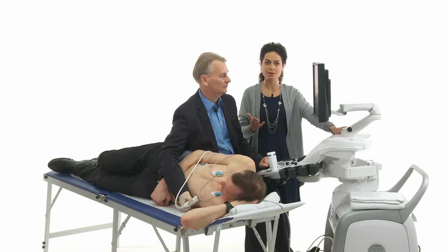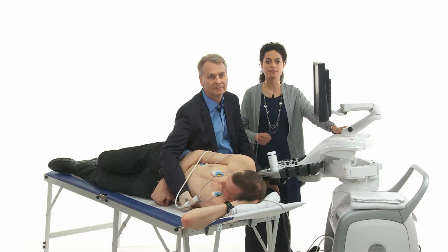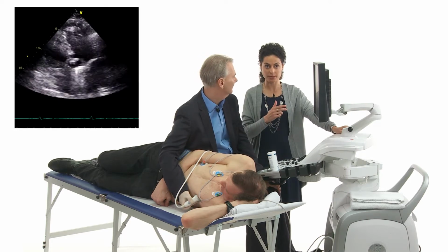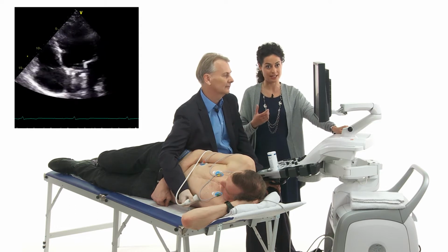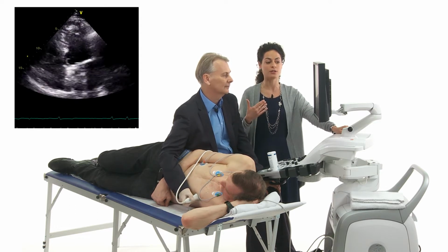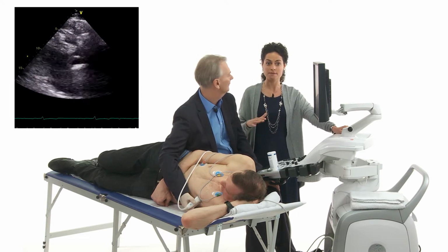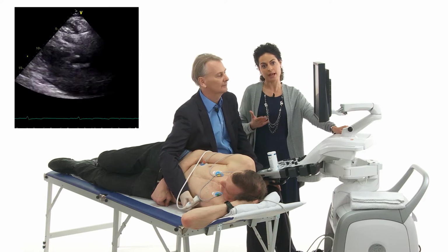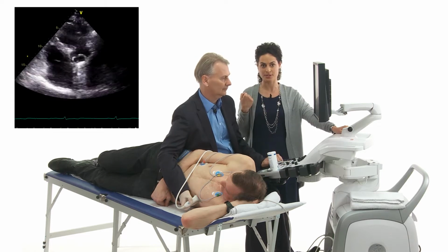Now let us turn to another patient and see how we can use color Doppler and continuous wave Doppler to look at the aortic valve. Our patient is 52 years old, and 14 years ago, he received the first prosthetic valve in aortic position, and this operation was associated with replacement of the ascending aorta, and later on he was treated also for the mitral valve, receiving another mechanical prosthesis. He's doing very well, and today we have a regular follow-up, and we will show you how to assess the prosthesis in aortic position.